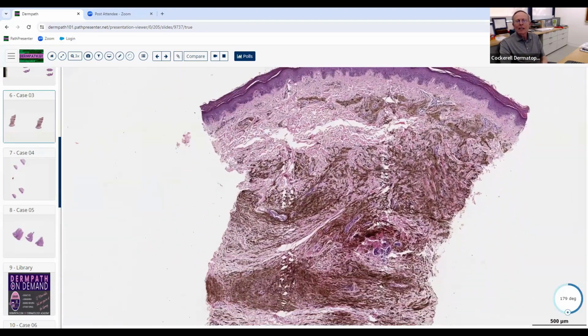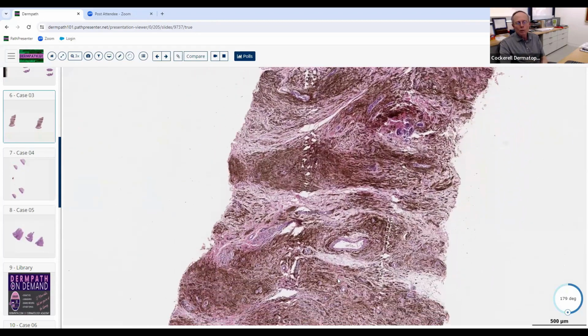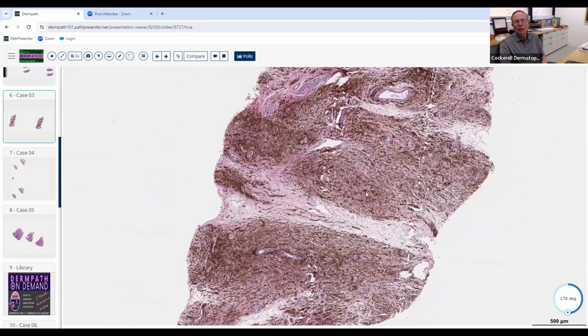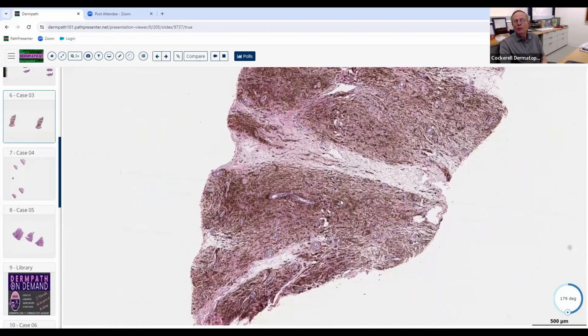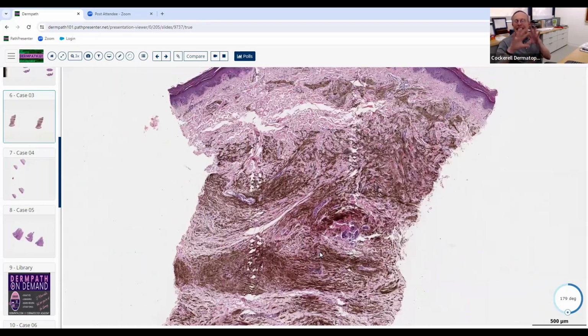Now you mentioned a few terms in there. They're probably not going to get into animal type melanoma. That's more dermatopathology board, so you're not going to have to deal with that. And they certainly wouldn't give you a punch biopsy of something like this, if that was even in the differential, because that's going to be a sea of solid melanocytes. They can be surprisingly not super atypical, but you might see an occasional mitotic figure. So that's a more challenging diagnosis to make.